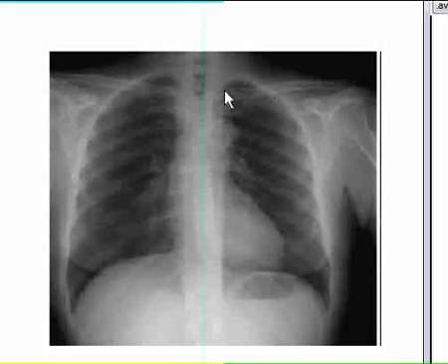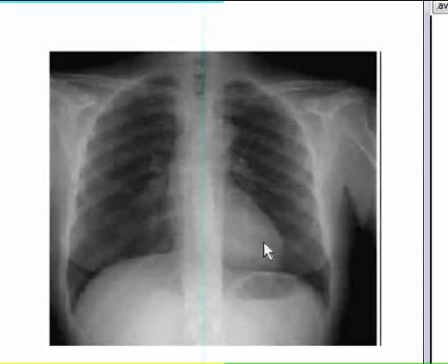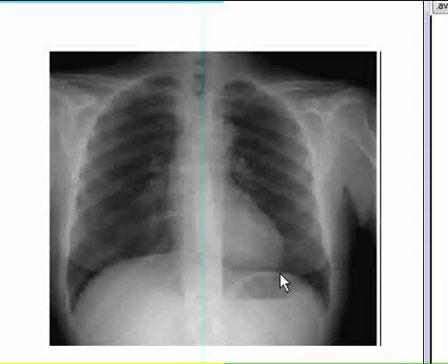This is the left apex. The arch of aorta and heart is visible here. This is the left cardiophrenic angle here.